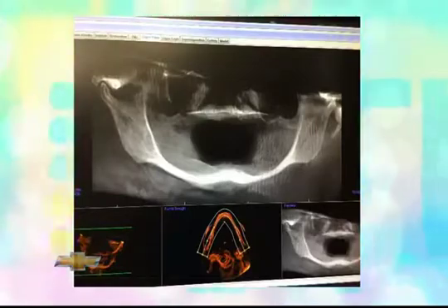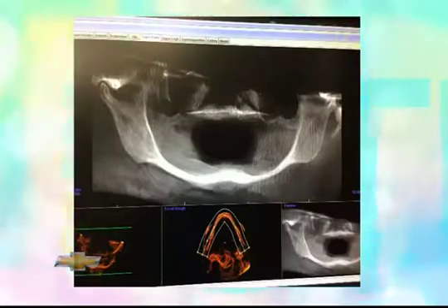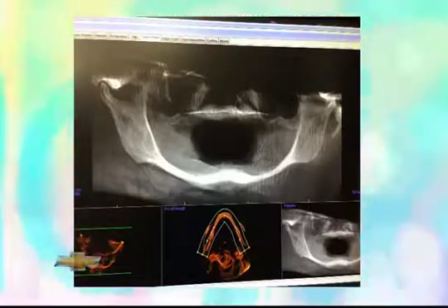If you look at this x-ray, this is a lady that came to me literally last week, an older lady who's had dentures for a long time. She and her husband were there, and they were saying that she can't eat with the dentures that she has because they have nothing to grip onto. Look at this x-ray, look on the left side and the right side, and you'll see how thick your mandible, your jaw, is supposed to be. She's had these dentures for a long time, and look how thin her jaw is at this point. The whole bottom front section is literally less thick than my little finger. It's like a pencil. Now, she can't have implants because she doesn't have enough bone even to put an implant in. It would break her jaw to even try. She waited too long. So don't wait too long is the moral of that story.